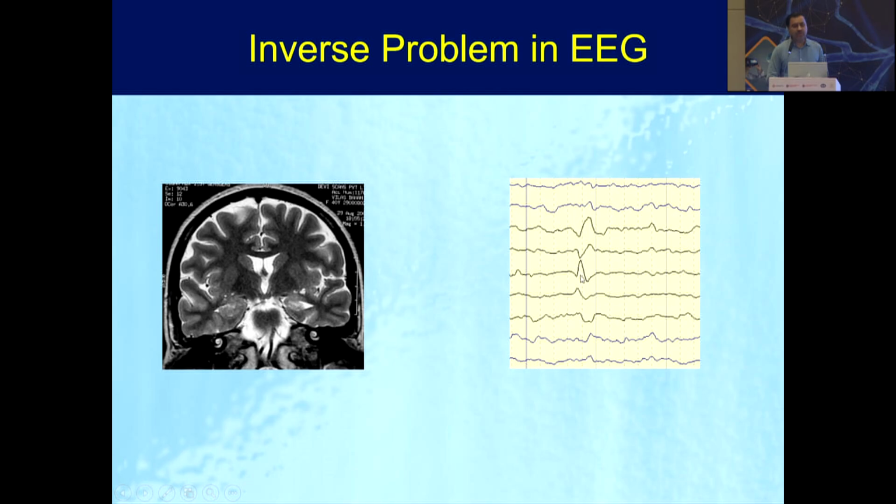And based upon this location, we deduce that this spike is coming from the temporal lobe. Now, we have to understand that this spike, which is on the surface of the left temporal lobe, can be produced from a source, maybe multiple. It may be coming from the left temporal, from the lateral temporal, from the insula, even from the basifrontal lobe. So EEG has a poor spatial localization.